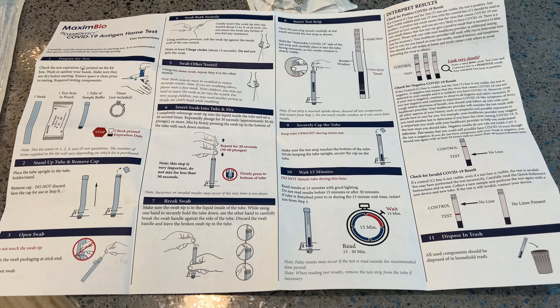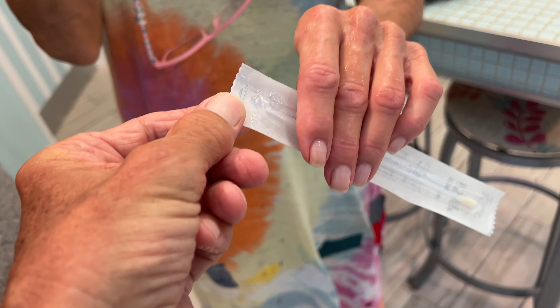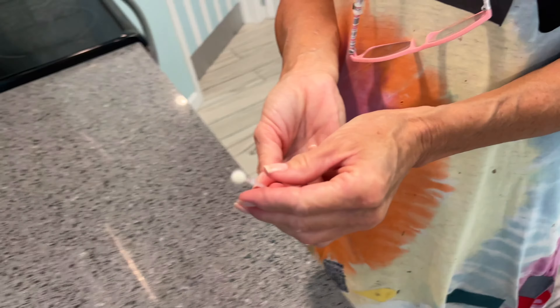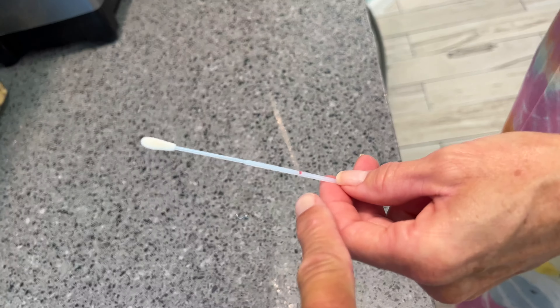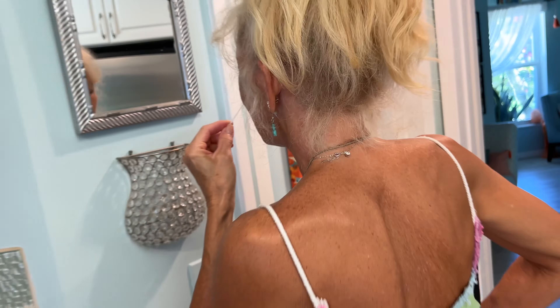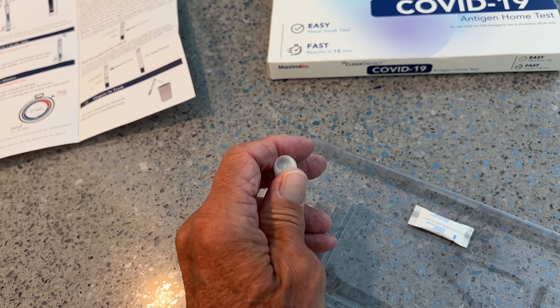All right, we'll give it a shot and see what happens. Open her up. She took her nose ring out. Just want to make sure you get it open. So hold it for just a second — I'm going to show you. When we put it in, afterwards we break this off inside of the thing. You see that little red line? So she's got to put it in her nose and swab it. Go! Do it, both sides. Get both nostrils. Hurry up, get the cap off.